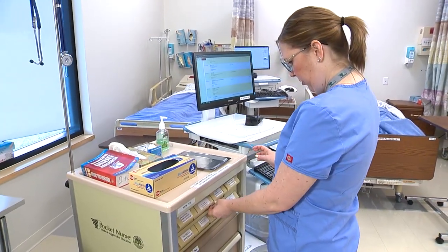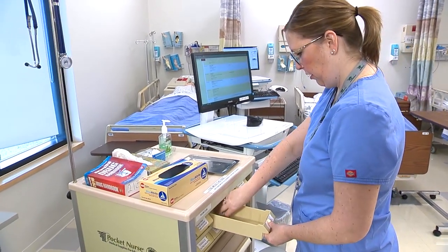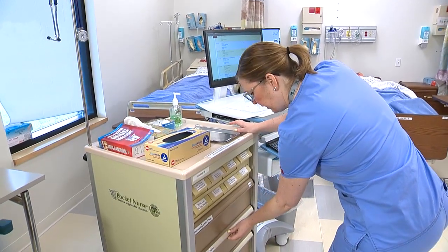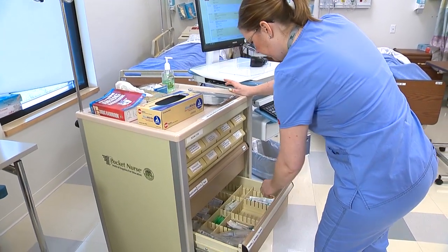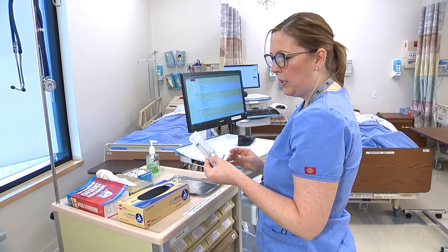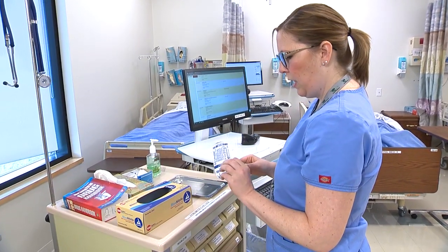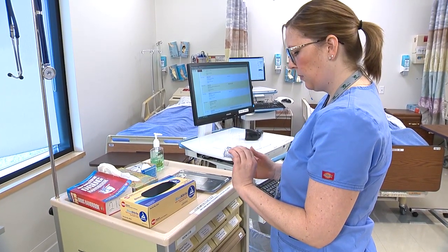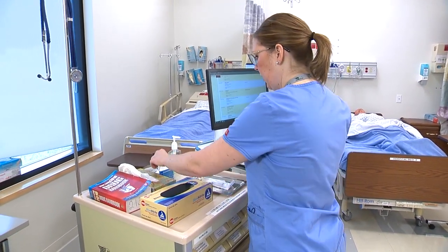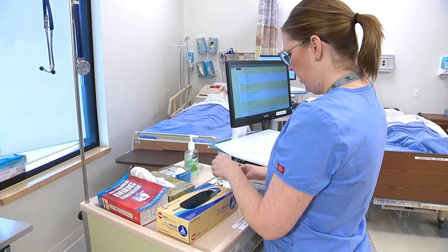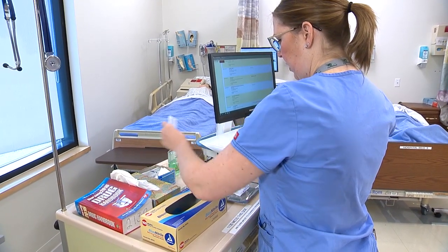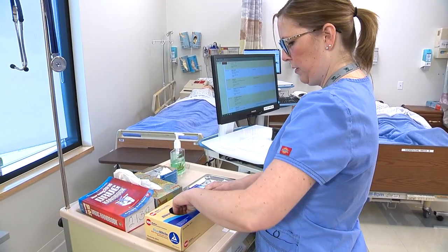I'm going to grab my medication. I need to grab a needle — with an IM injection you want at least a one to one-and-a-half inch needle. I'll also need a two-by-two gauze pad, some alcohol, and of course my gloves.